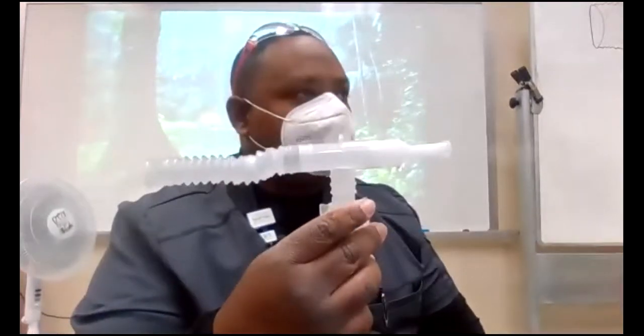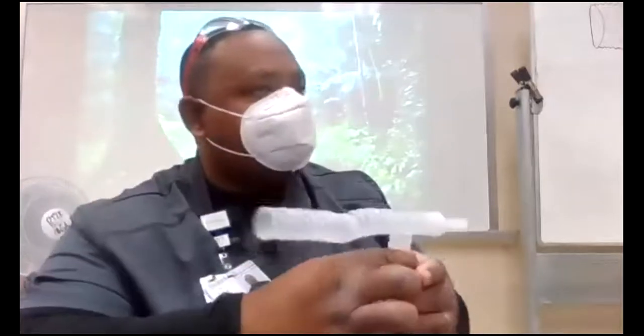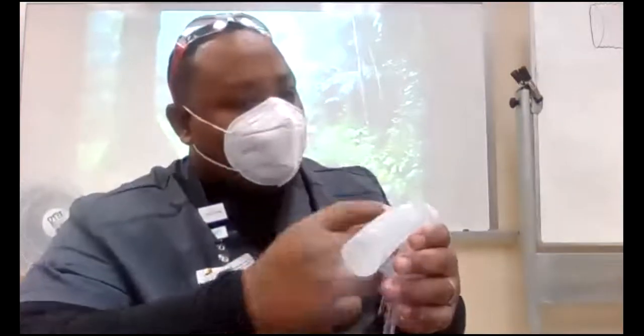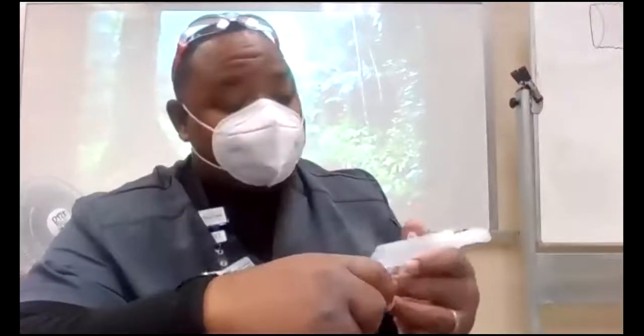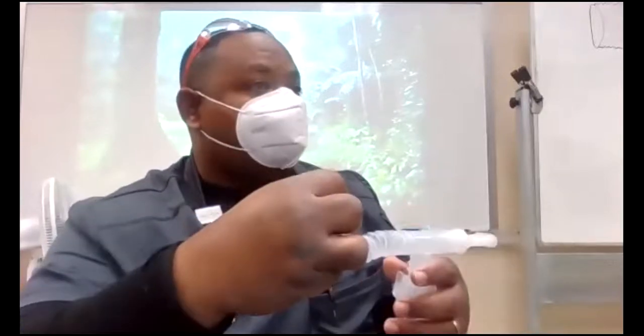See that? That's my aerosol breathing treatment. So the other end is always open. It's always open. This is my reservoir tube. So as I'm breathing, my breathing treatment through here, there's always some right there collecting. So when I do take the next breath, I get this. If I don't have this here, then that's just being wasted, right? It isn't really catching a whole lot, but it does make a difference. Okay? It does. If I close it off, then I can't exhale. So you never close it off.